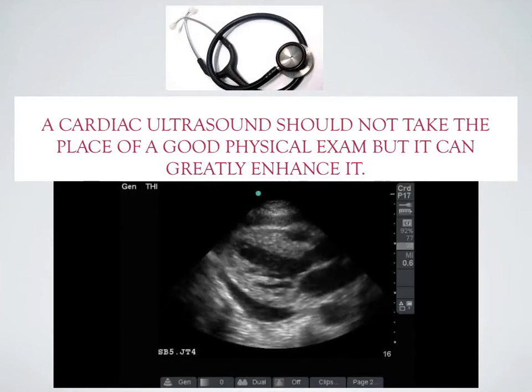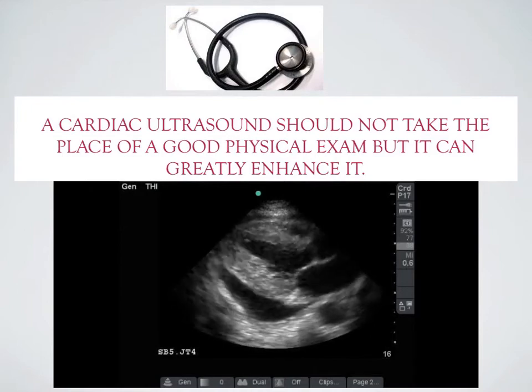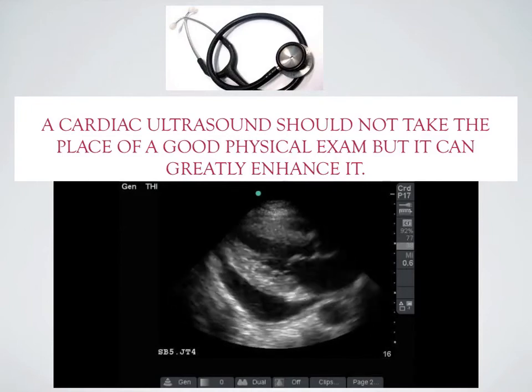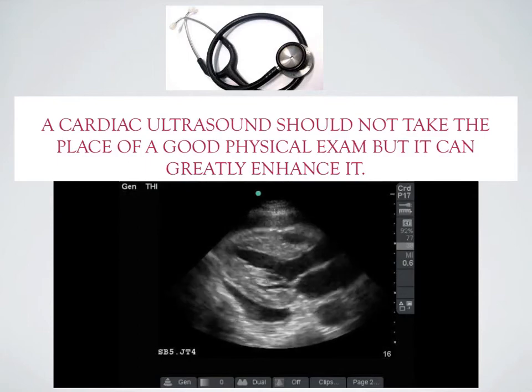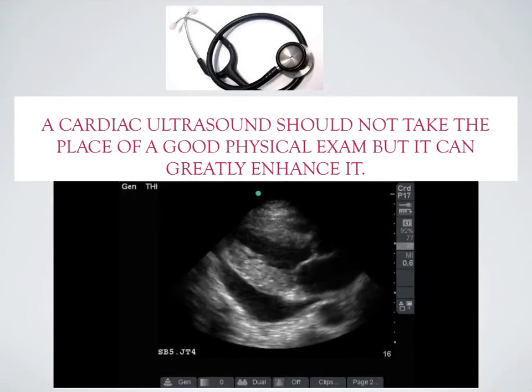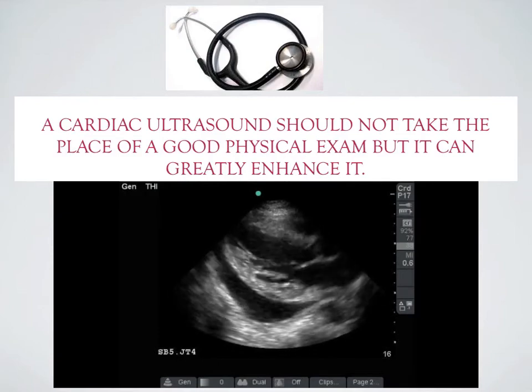Now, don't get me wrong. A stethoscope is an important part of the physical exam, and a cardiac ultrasound should never take the place of a good physical exam. Physical exams are crucial, and that should never be misunderstood. But ultrasonography can oftentimes greatly enhance the physical exam.